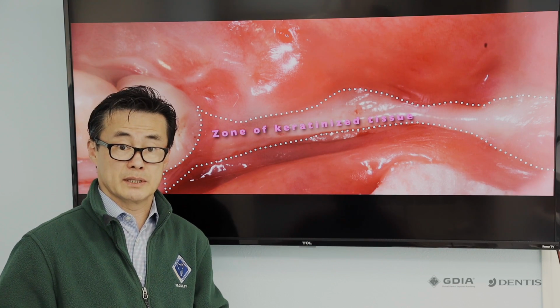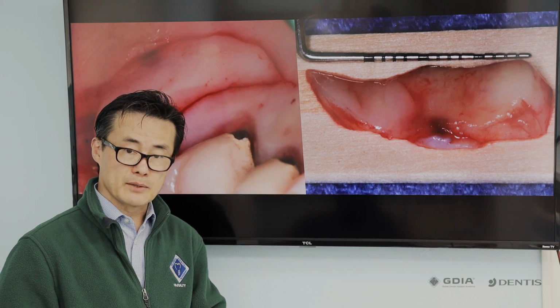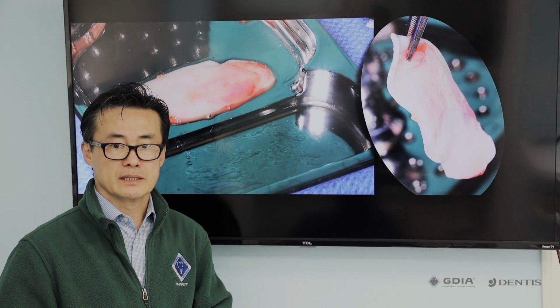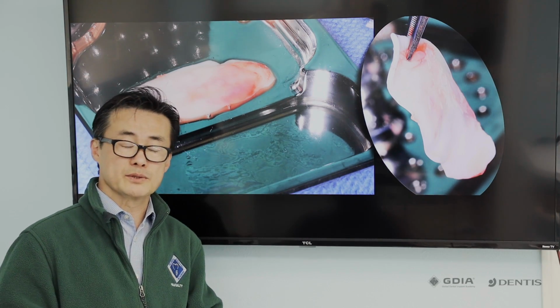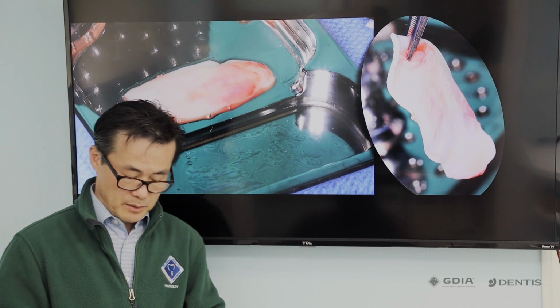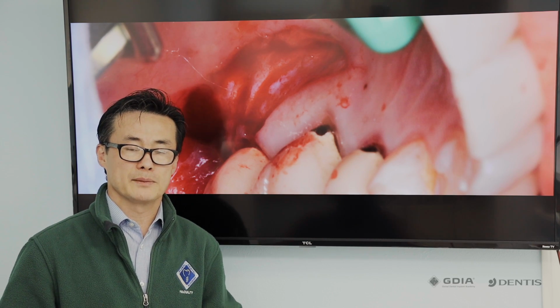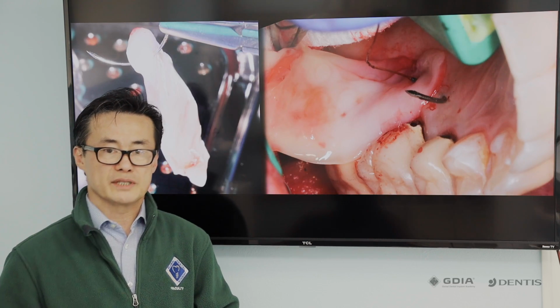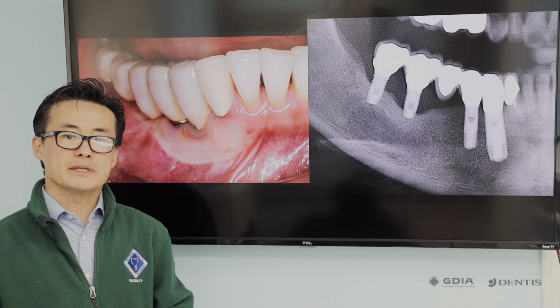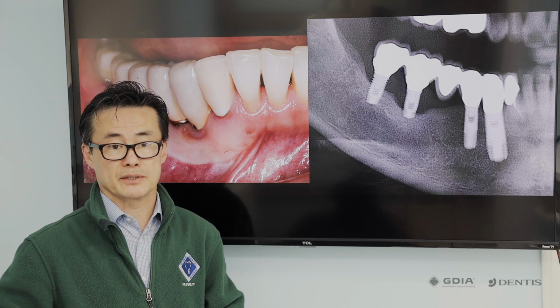and be able to move on even to some keratinized tissue augmentation where there's quite limited amount of gingiva. We go to the roof of the mouth, all in the same day, same surgery, be able to do that. And in a different section we'll talk about the use of concentrated growth factors, CGF. But CGF can be used in this type of situation very commonly to be able to dress the wound that's otherwise quite uncomfortable. Yet another example of piezoelectric surgery device that we can use very readily.